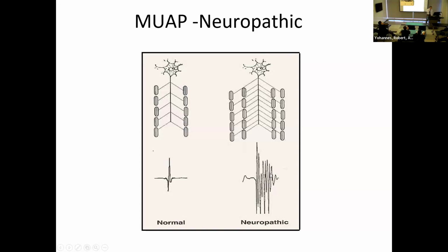It will be more incorporated and more synchronous with the original unit. Where do we see it? We see it, for example, in patients who had polio when they were young. So they had the denervation when they were young, and now many decades later, we, for whatever reason, do an EMG. We'll see these gigantic units, but they will have less of this polyphasia.